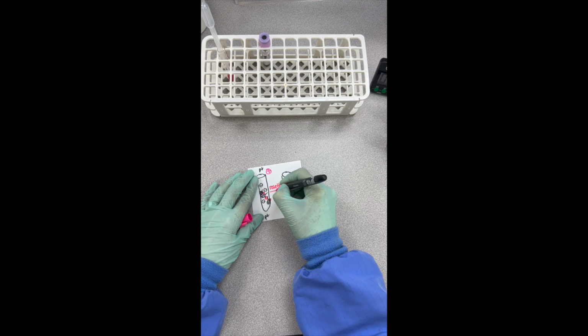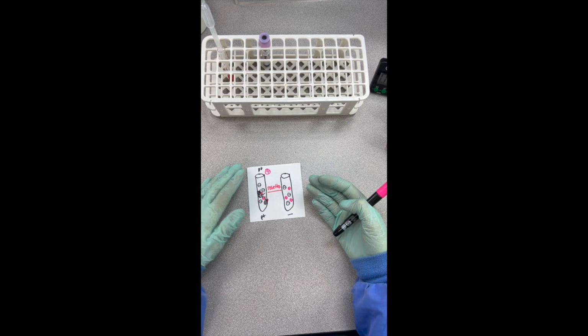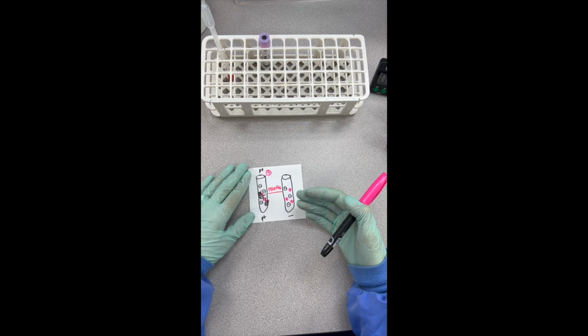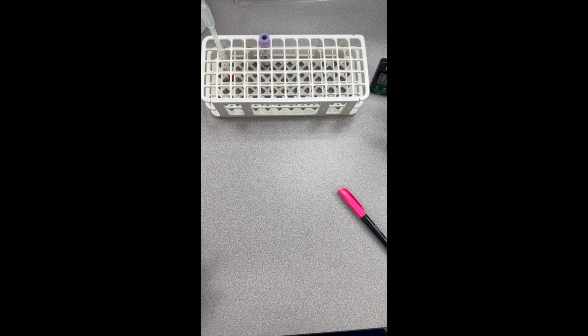Okay, that's what we're looking for in a fetal screen, those rosettes. And you can't see them macroscopically with your agglutination viewer. You have to take these to the microscope and look at them under the microscope to see those. And I'm going to show you how we do that next.